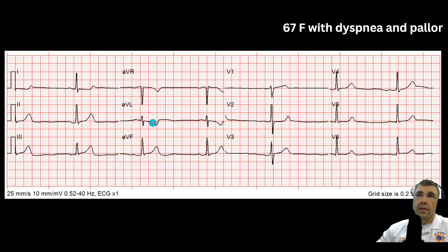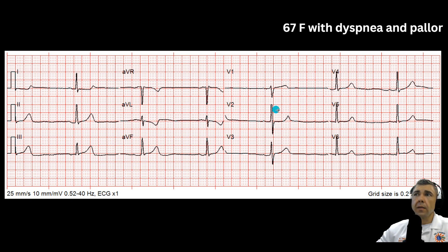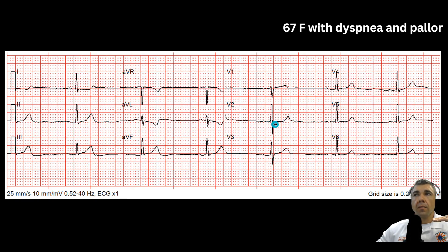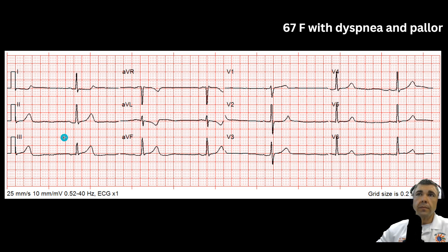The next thing that's going to happen is that AVL change gets deeper, and then the inferior leads will start to elevate — probably lead 3 first. You also have a very flat ST segment in V2 with a tall R-wave. You shouldn't have a tall R-wave in V2 — that's called early R-wave progression, meaning your precordial axis has rotated. This is actually a posterior Q-wave, because V1 and V2 are reciprocal to the posterior wall. If you flip them, this becomes a Q-wave, and that flat ST segment will depress further because it's a posterior infarction. So that is an early inferior wall MI.